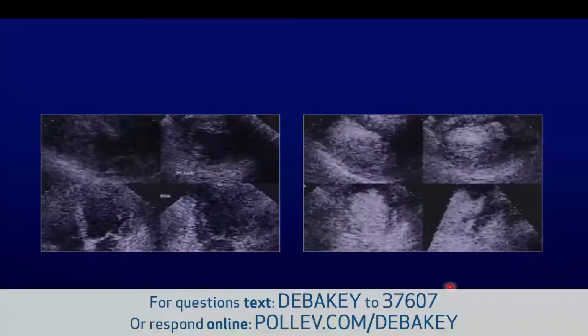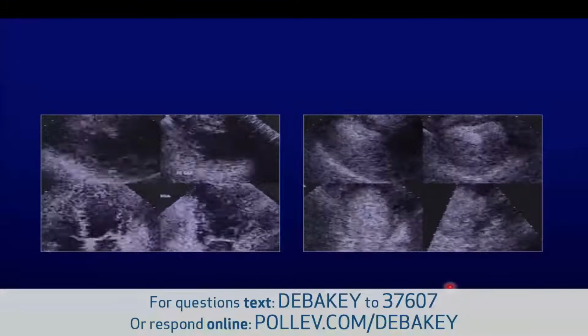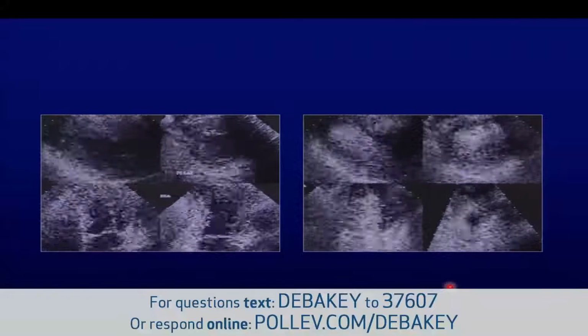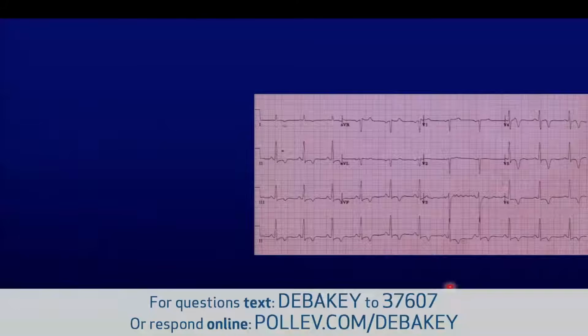So I think agents nowadays are much more available. People are much more comfortable with it, and what you're driving for is quality of the interpretation, basically, of the total study. I mean, this is the same study. You're going to have to decide when to use it, particularly when you're not sure about what you're seeing.